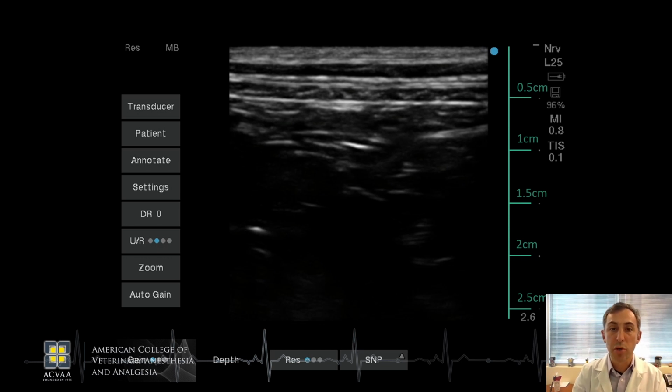In this slide, I want to show you many things. So first of all, look at these white lines. I will explain this later. There are at least 4 white lines that are very clear in this picture. We have this marker. This is your ultrasound indicating where the needle is going to be showing up. And also, very importantly, this is your 1 centimeter mark for your patient. After reviewing what these structures are, you will realize how superficial the structures you are trying to identify are. So let's go to the next slide.